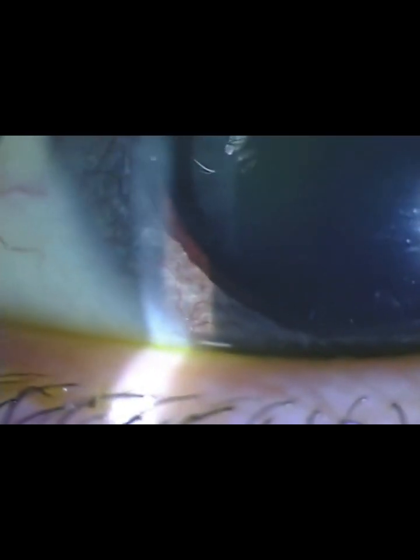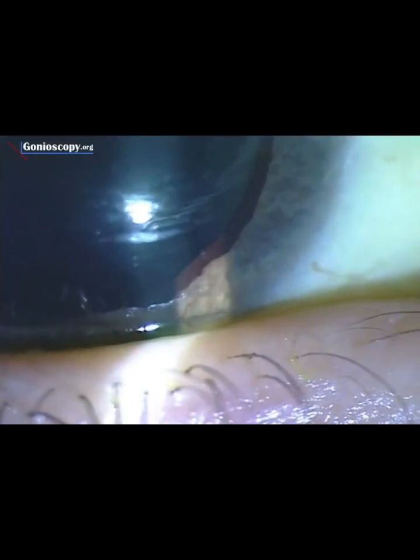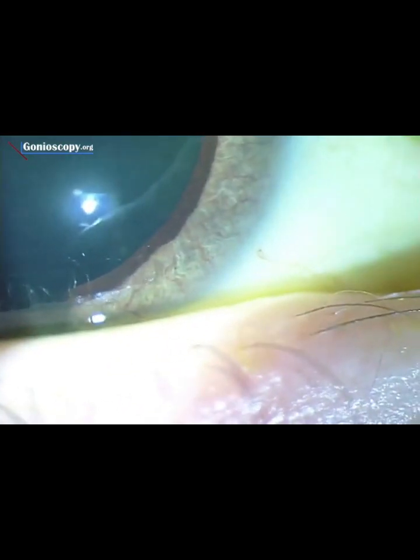This 21-year-old man has had diabetes since 2 years of age. He has severe proliferative diabetic retinopathy. We can see that his pupil is permanently dilated, that he has marked rubeosis iridis, and that he has ectropion uveae.